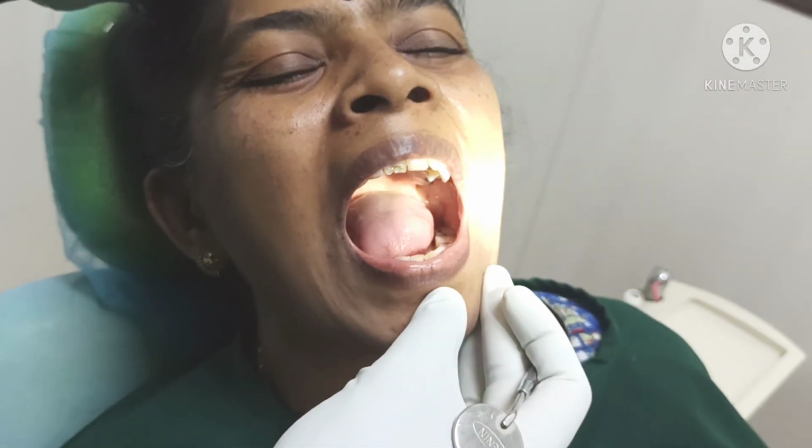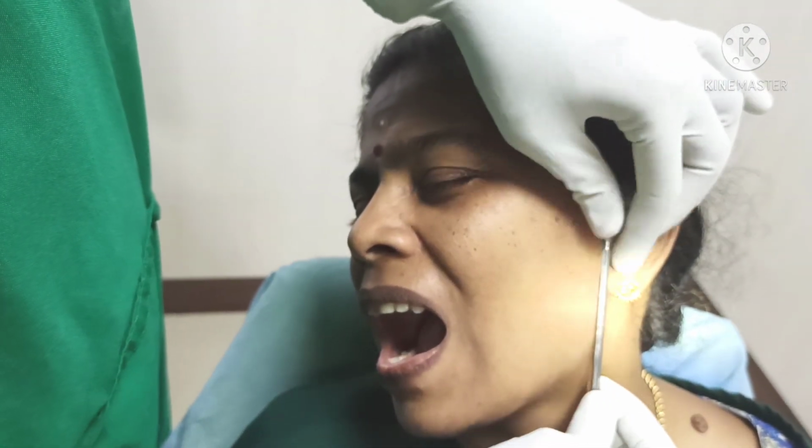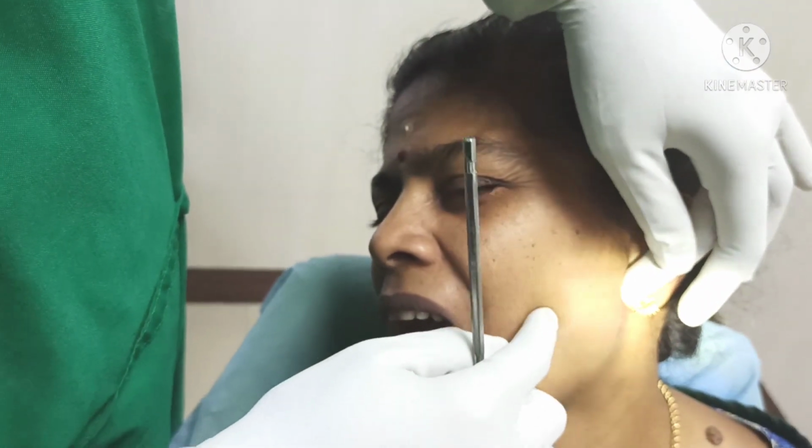Okay, there is one more technique, one more thing I will add now. As we already discussed, the ramus thickness. Okay, turn to this side. This is the posterior border of the ramus, and this is the anterior border of the ramus.